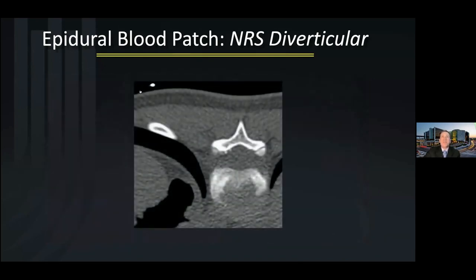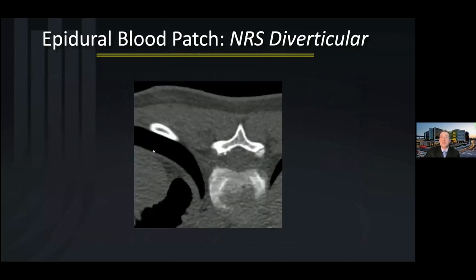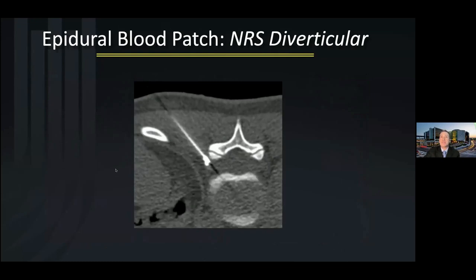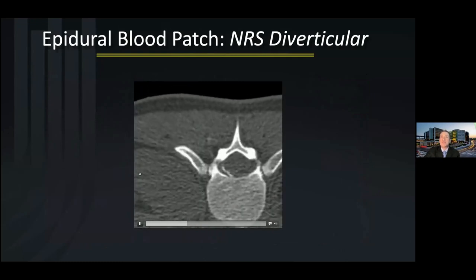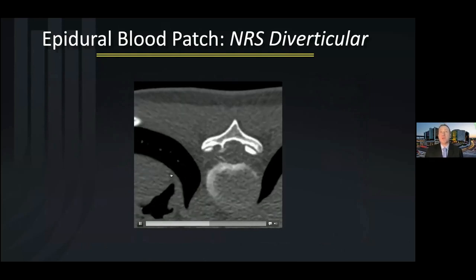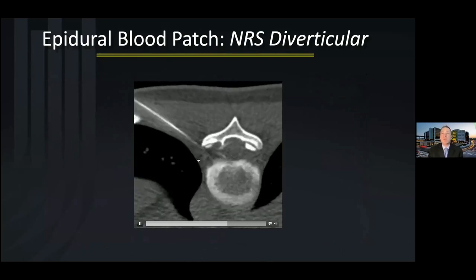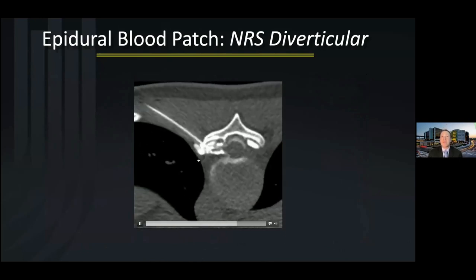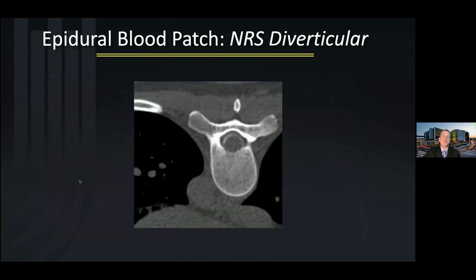And so this is how we treated her leak. So here, posterior oblique approach, we're going to basically put our needle immediately adjacent to the leak, as you're seeing here, injecting our contrast, confirming we're in a safe space, and then go ahead and put in our patch material. Here we used both fibrin glue and blood in order to get a really durable response. You can see we did two separate needle placements here at two different levels to get a really excellent spread around that T11 nerve root sleeve. And she was successfully treated with this patch.